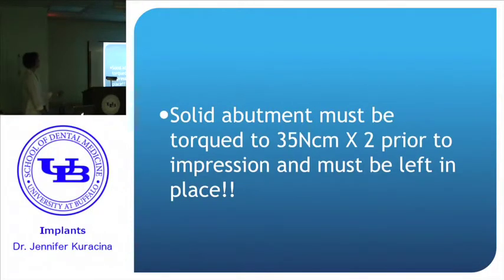And the important thing you have to remember with the solid abutment is that this is a one-piece solid abutment. There's no screw and there's no thread timing. So you have to place that abutment and you have to torque it twice before you make your impression. If you torque it once and you make your impression and you torque it again and that thing moves a little bit, you've just created an inaccurate cast.